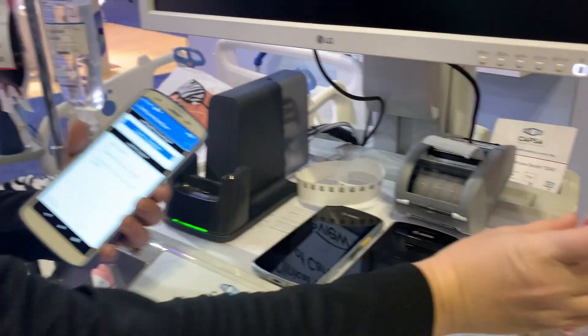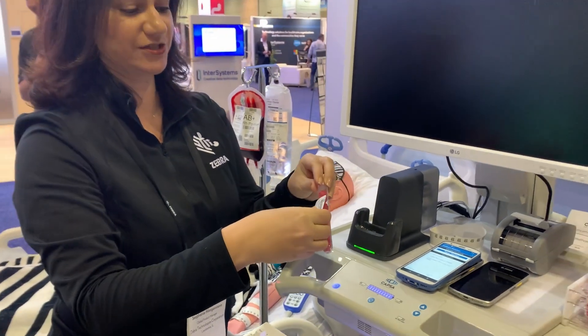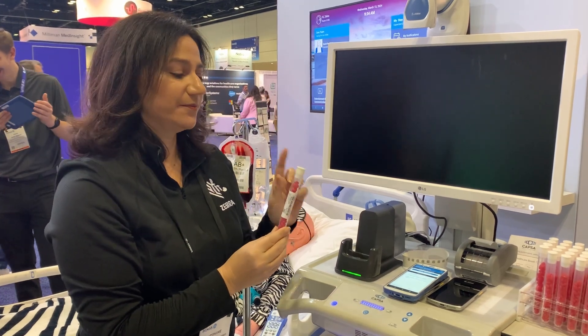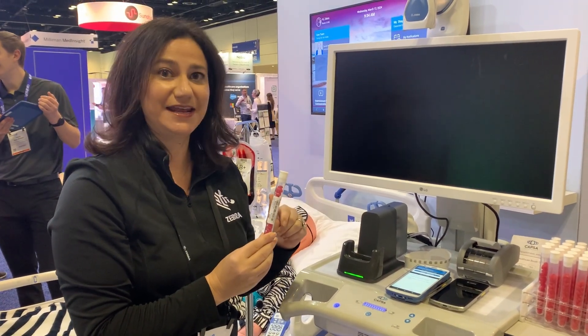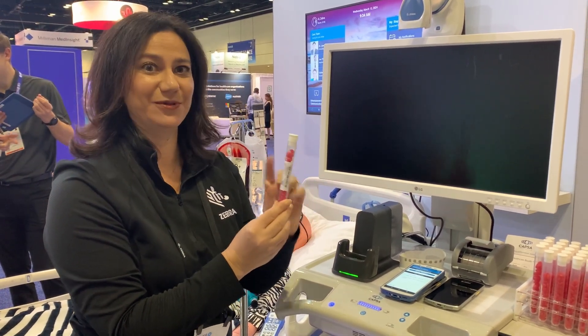And then I'm going to take that label and put it on the blood that we just withdrew in front of the patient, so that they now know that the lab was for the chart for the doctor that requested it, and that it's their blood in the test tube with their label on it.